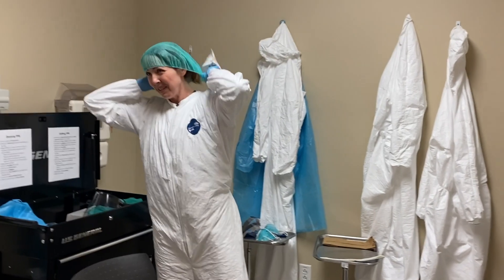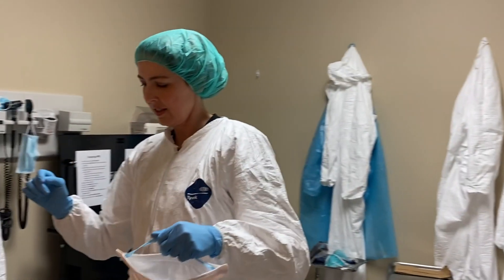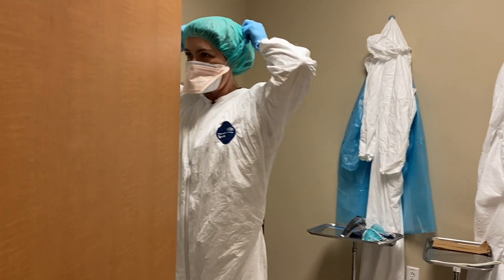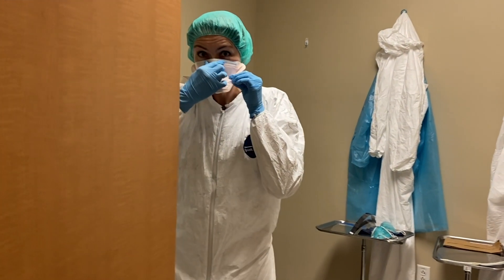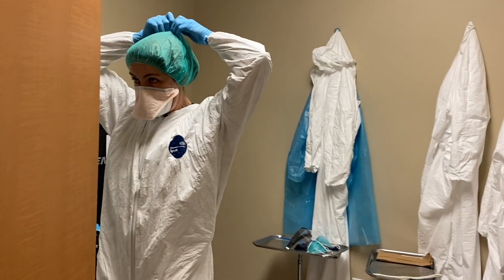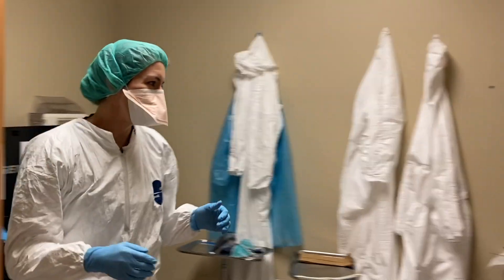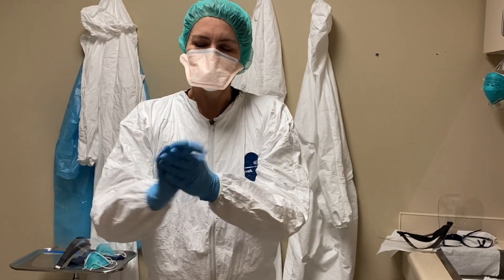I can show you a good way to put the N95 on — I kind of hold it like a gun. Got my duck bill on. Make sure that I pinch it around my nose and make sure it's tightly fitting around my face. Once again, sanitize with some hand sanitizer.